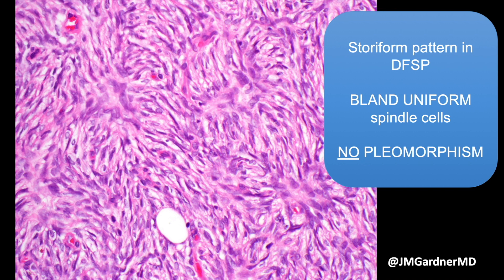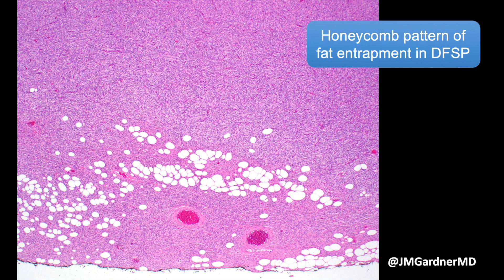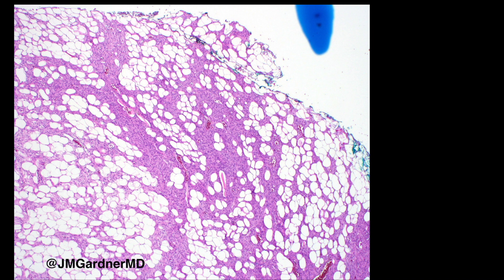The storiform pattern — this beautiful swirly, whirly growth — is very visually distinctive, but you really have to see it. Some DFSPs have it and some don't, and other lesions like dermatofibromas can also show storiform patterns, so it alone is not enough. What we really want to see with DFSP is those bland swirly spindle cells infiltrating and entrapping adipose tissue in a so-called honeycomb pattern: islands of fat trapped in the midst of the tumor, tightly wrapped by tumor — a very characteristic Swiss cheese or honeycomb appearance.